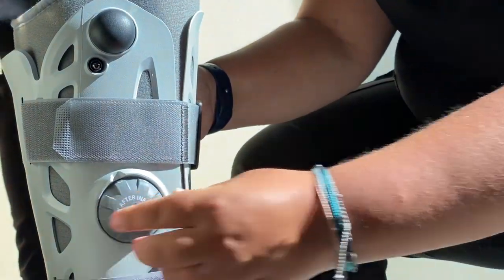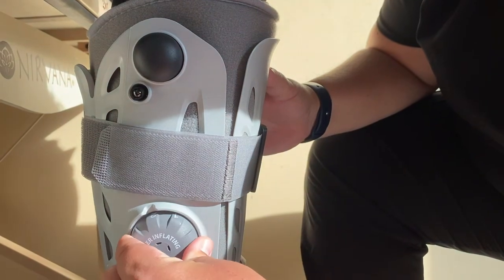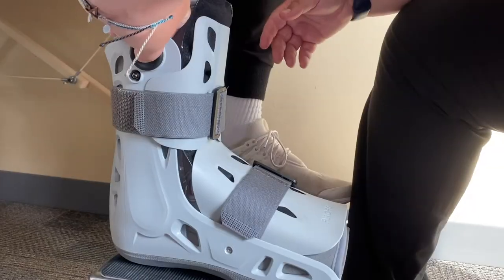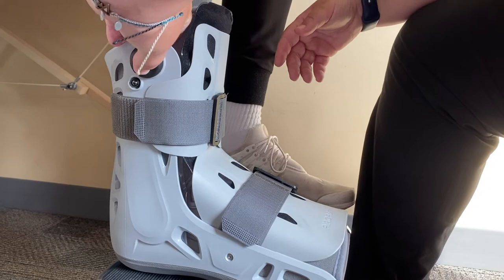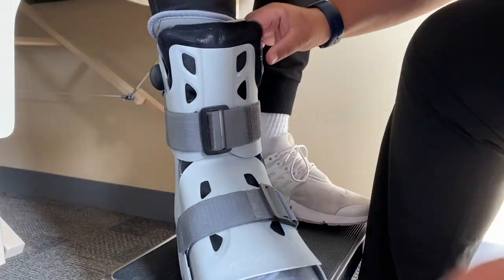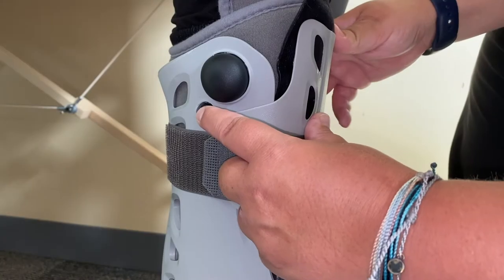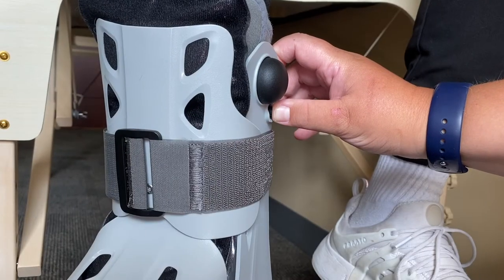To release the air, turn the dial to either number 1 or number 2. Press the release valve button next to the dial which will release the air from the respective air bladder. If you have a short boot, press the round inflation button on either side of the boot. The inflation button on the outside will fill the outside air bladder, and the inside inflation button will fill the inside air bladder. To release the air, press the small release valve button which is located next to the inflation button.